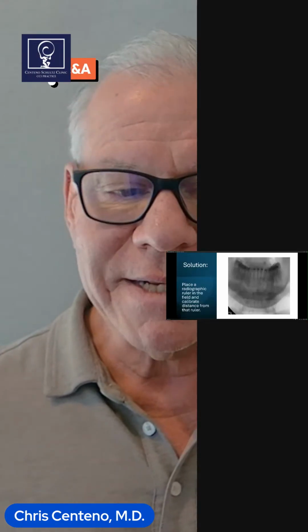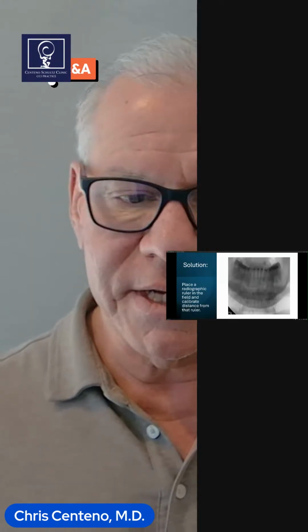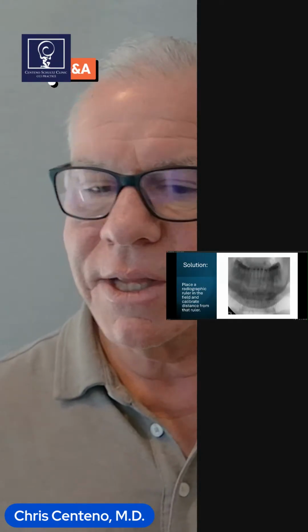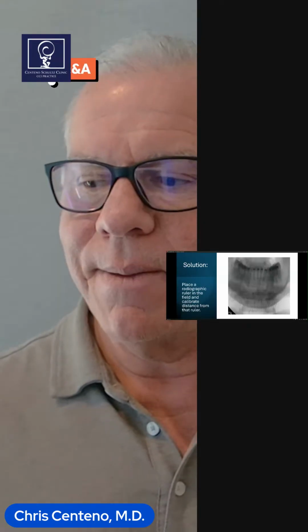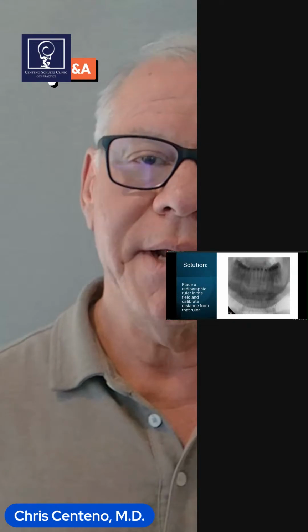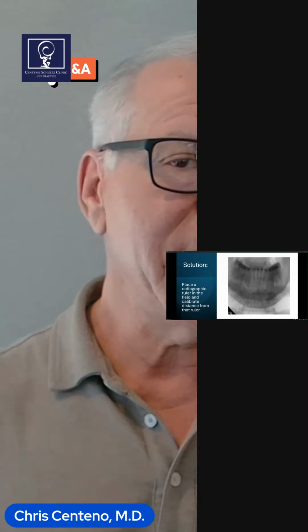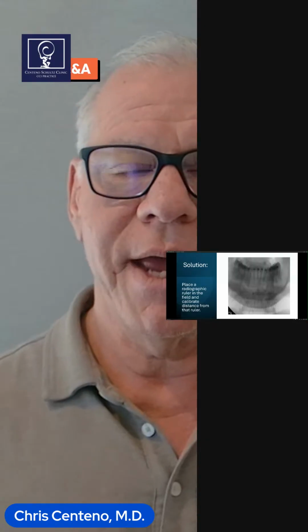So in order to fix that, we started looking at using a radiographic ruler, which you can see, it's that ghost-like ruler image that you can see there on the bottom of that AP view. And what this allows me to do is it now doesn't make a difference at all where the patient is located, where the machine is located.